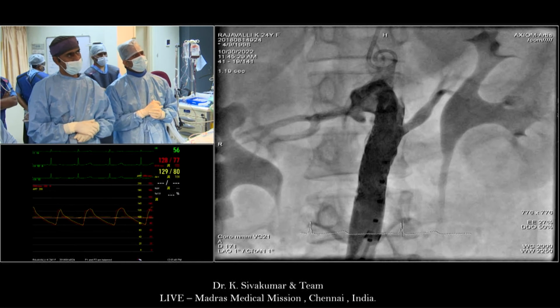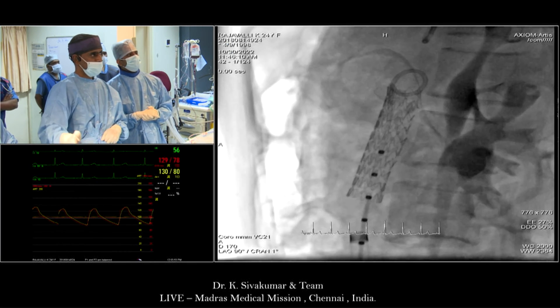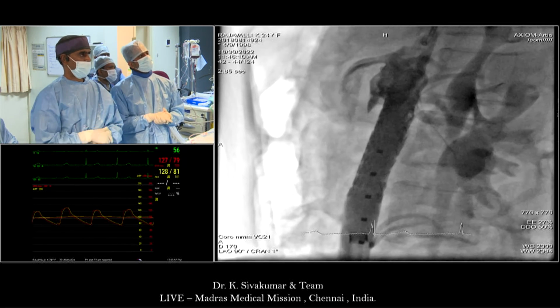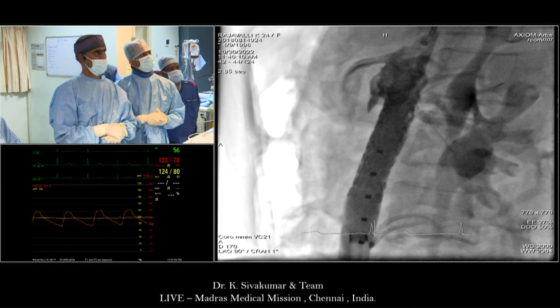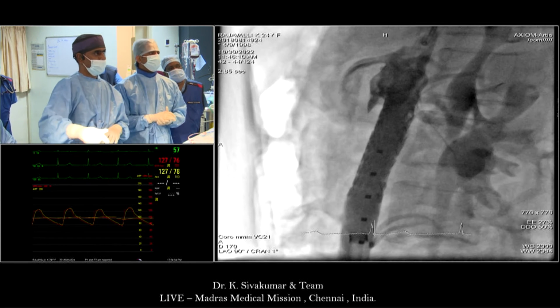I agree with you. In these situations, it gives in very easily once it is opening initially, maybe with high pressure opening, but then it seems to give in very easily and sometimes it tears. Yeah. So this is on a lateral projection. It looks pretty good to me.